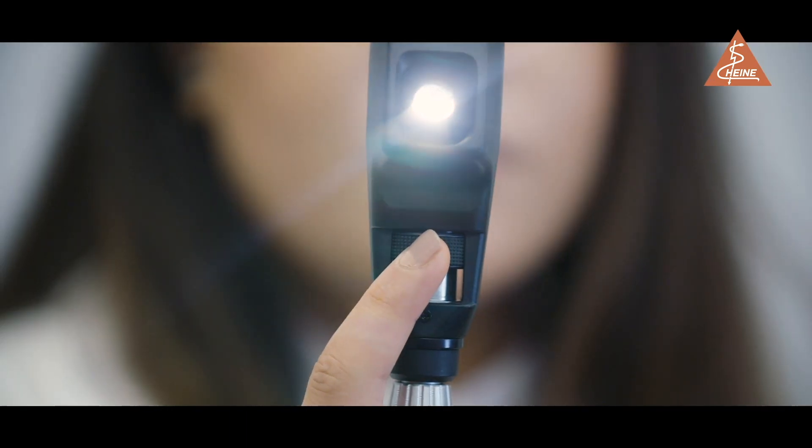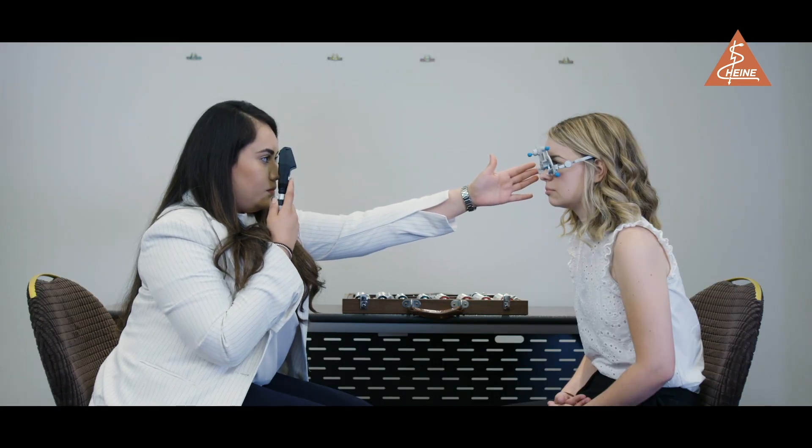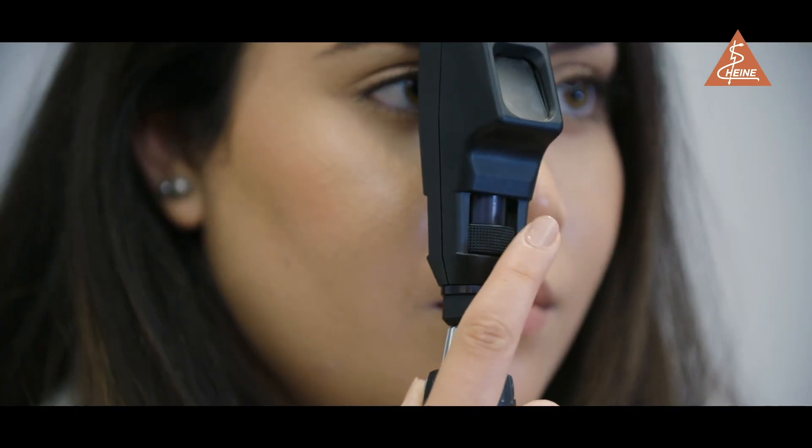Ensuring your retinoscope collar is set to use divergent light and that you are at a working distance of 66 centimetres, sweep the beam both vertically and horizontally across the pupil.